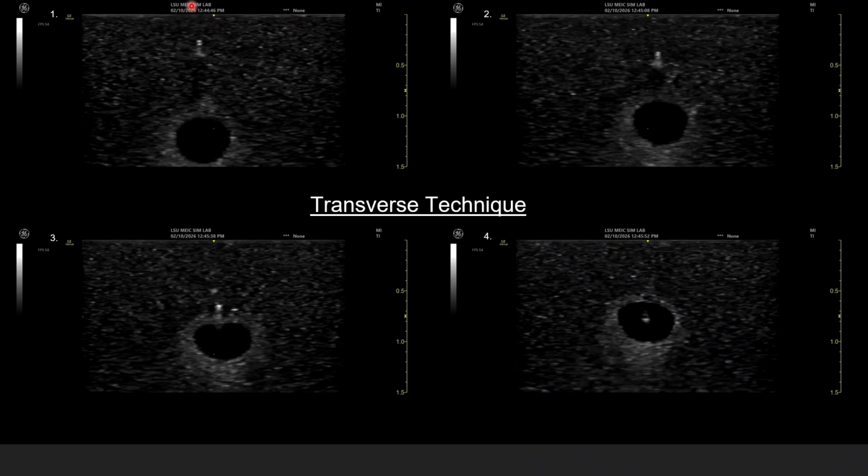So I take my needle, gently pass it through the skin without going very deep, keep it pretty superficial, and then put my probe, slide back, and locate the needle. Then I'd slide distal to the needle and lose it, and then I advance my needle into my view. So now I'm a little bit deeper. And then I keep progressing that same technique, which is called inchworming. So I'd slide my probe further from this image until I only see this gel model, and then I advance the needle into my view again.